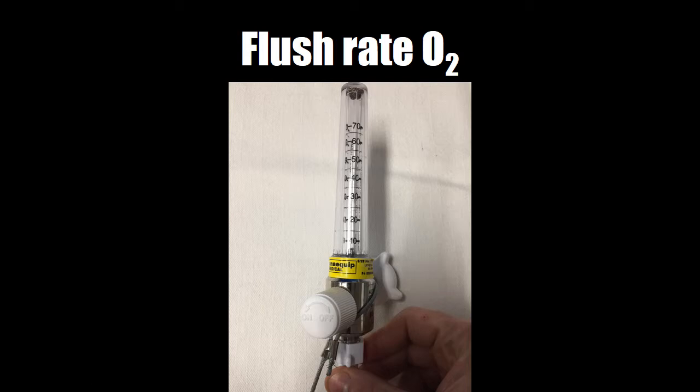It's very easy to become distracted when you're pre-oxygenating because you're often the team leader as well. So you're taking your hand off, removing the seal, and actually losing any benefit of pre-oxygenation. So I do personally prefer the non-rebreather technique, but with the higher FiO2, and I think that's the way we should be going for added safety.